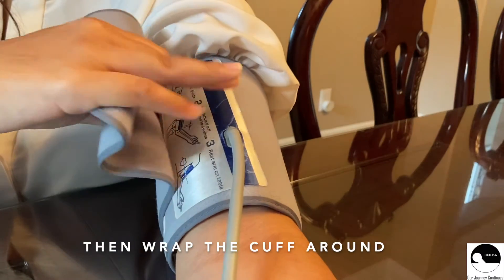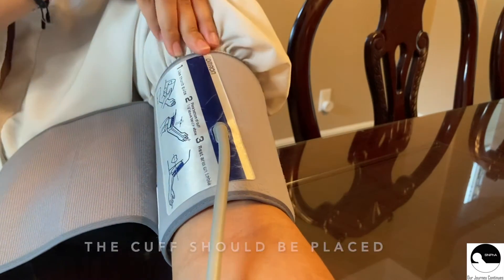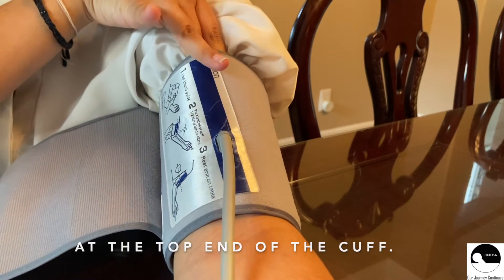Then wrap the cuff around with the appropriate snugness. The cuff should be placed tight enough so that you can fit two fingertips at the top end of the cuff.